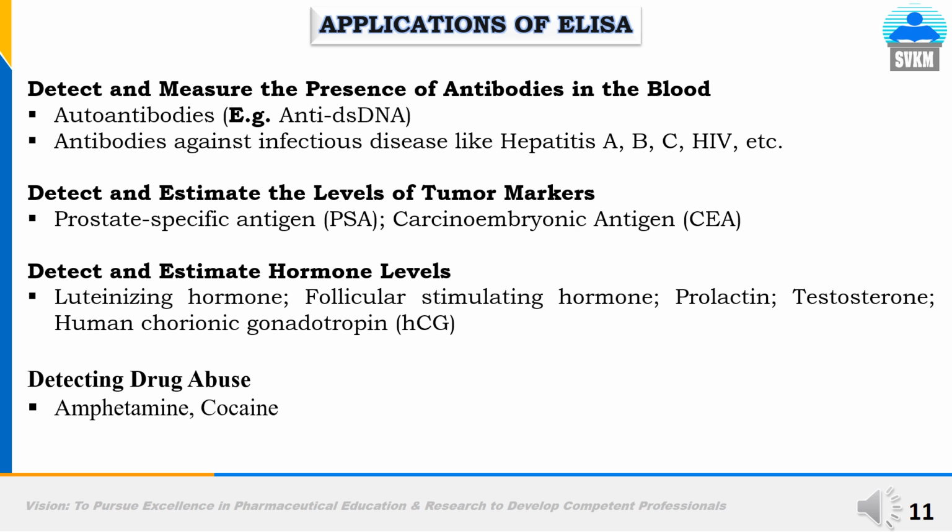ELISA is also utilized in detection of drug abuse. The drug abuse for various drugs like cocaine, amphetamine.